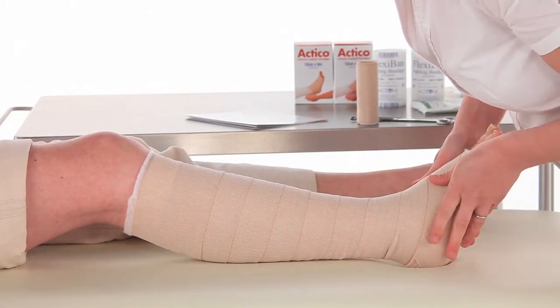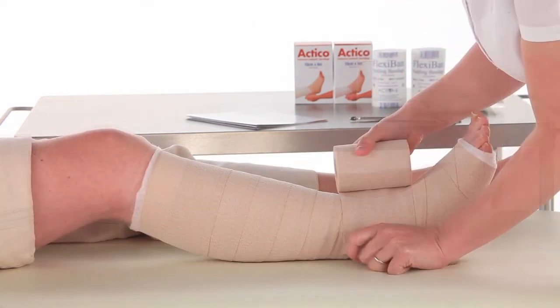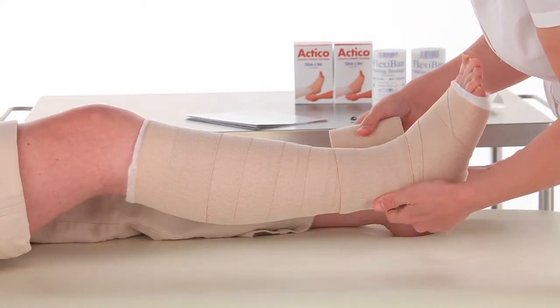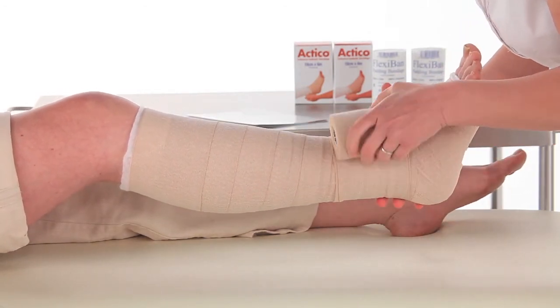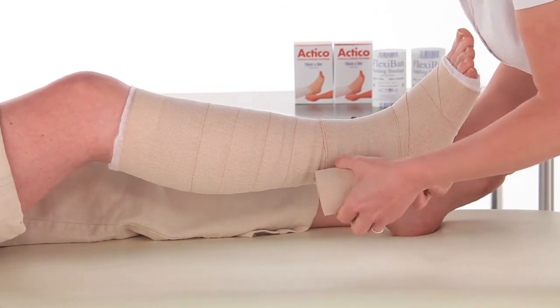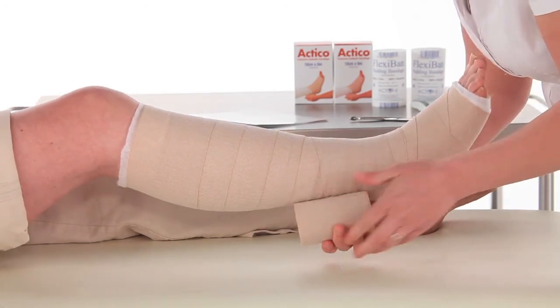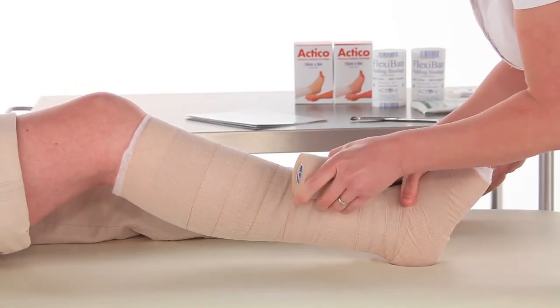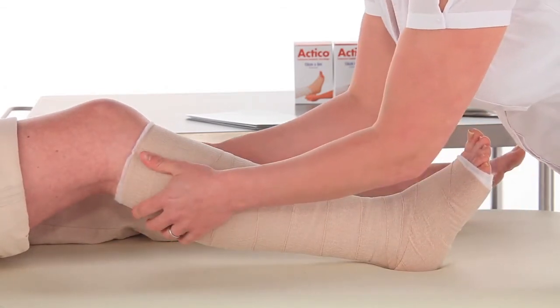If the ankle circumference after padding is more than 25 centimetres, an extra Actico layer will need to be applied from the ankle. Apply the second Actico 10 centimetre roll in the opposite direction. Secure with two turns with tension over the ankle and on the third turn follow the lock and roll method. Ensure the layers are bonded and finish as before.